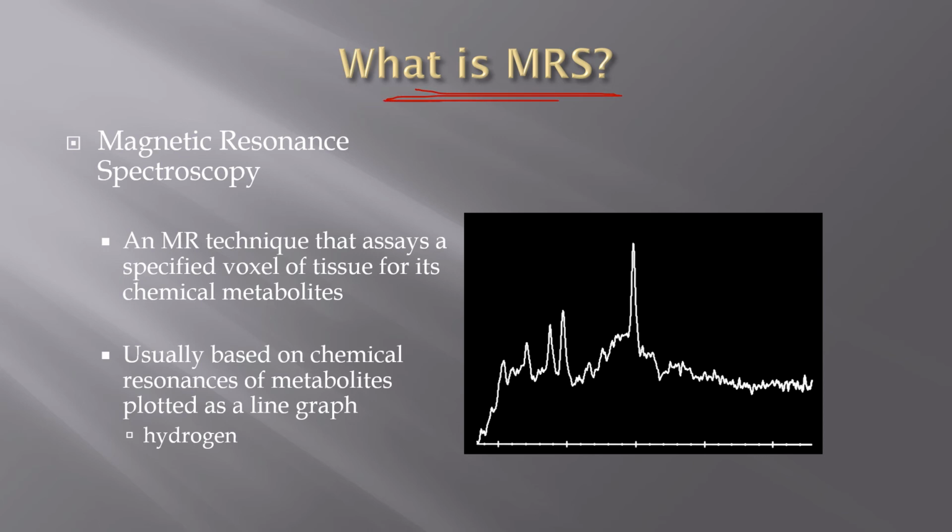So this is an example of magnetic resonance spectroscopy. You look at specific voxels, basically a little less high res than a normal MRI. Probably should look at something at 3T, probably 1 centimeter by 1 centimeter. That's often a little bit to the small side, just depends on how much solid tissue versus necrosis is in the voxel. You love it if you can have a 2 centimeter by 2 centimeter lesion.